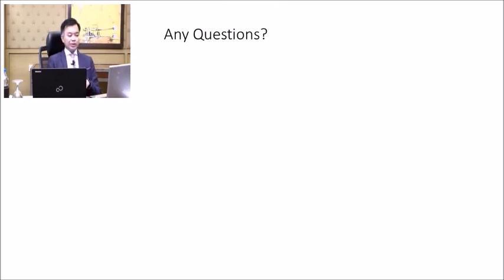How do you reassure patients with dysphotopsia? Well, this is really important. The important thing is to tell them before surgery that they may have dysphotopsia. In most Symphony patients, they won't, but in those that do have dysphotopsia, they will find that it's not a surprise. And similarly, in the trifocal groups, you tell them they will have dysphotopsia. When they do have it, they're not surprised, and either they get used to it, or potentially, if it's very severe dysphotopsia, you may have to consider performing an intraocular lens exchange. But in the Symphony group, you can see the level of dysphotopsia is exceedingly low, and I've never had to do an IOL exchange for a Symphony lens.